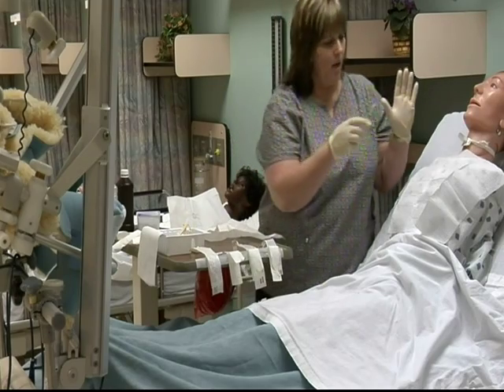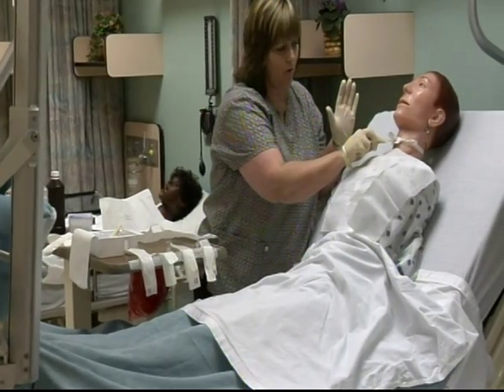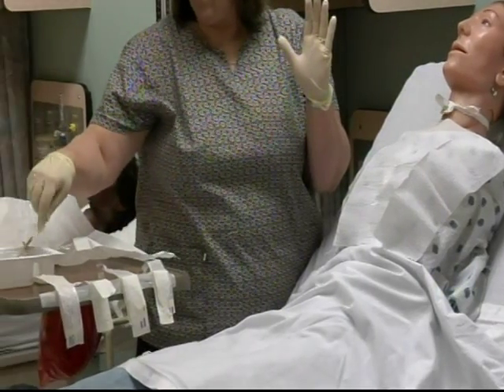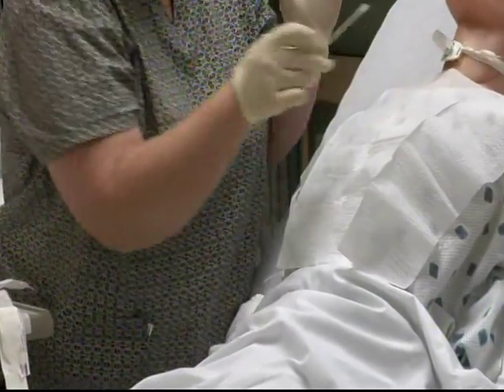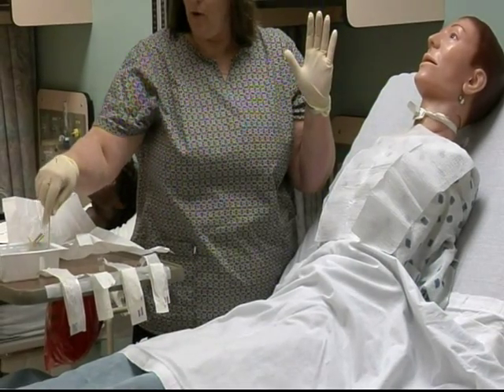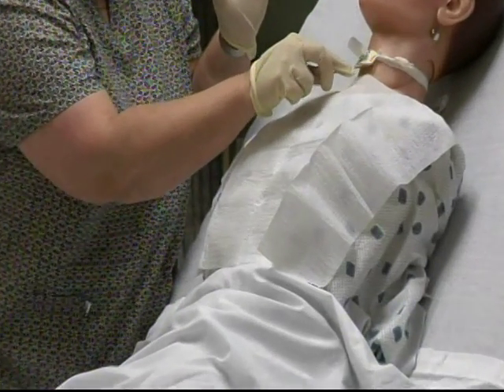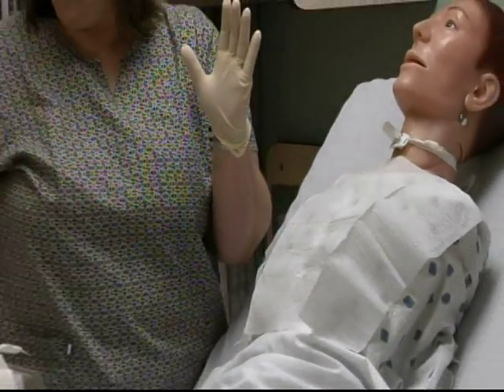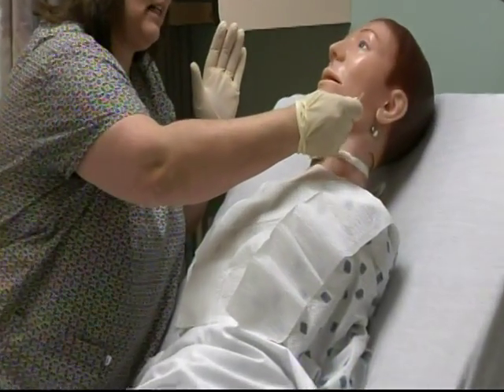Take your peroxide, and what you want to do is clean real good your flange on one side. Get rid of it. Take the peroxide again, the opposite flange, clean it real good because this gets real dirty. Throw it away, but make sure you keep your hands above your waist. Take your third Q-tip, go up under to where the actual trach goes into the skin, clean it real good, get all that crust off. Get your last Q-tip out of the peroxide, go in the top, clean it real good.